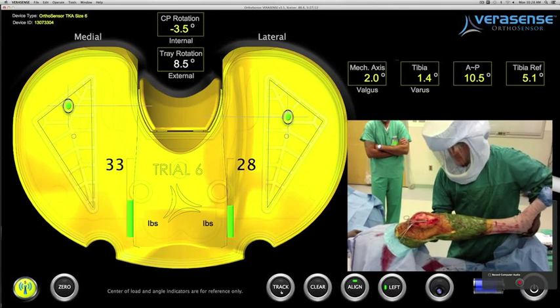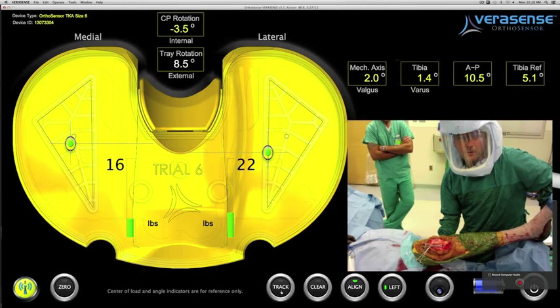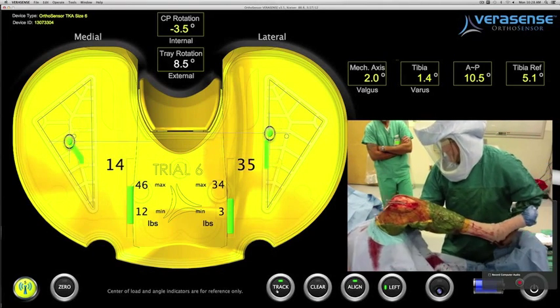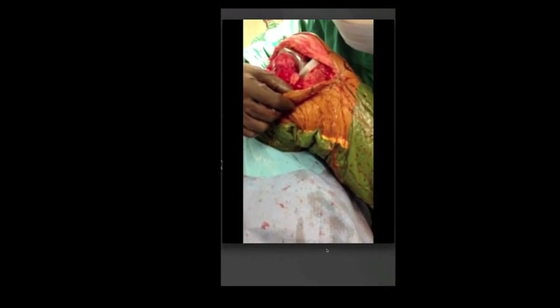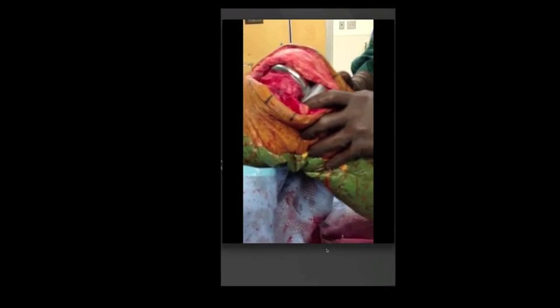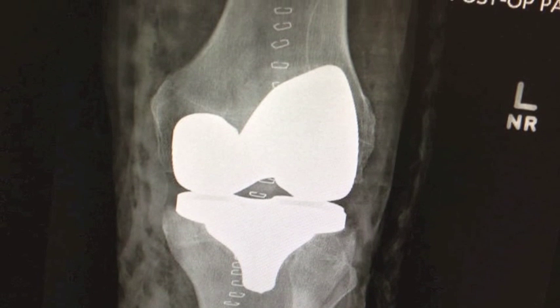The surgeon has utilized both the alignment from the accelerometer as well as the central loads through a full range of motion to optimize this patient's knee intraoperatively. He has excellent intercompartmental balance, and when taking the knee through a range of motion, demonstrates symmetrical rollback and balanced flexion and extension space. The final implant is inserted. The surgeon takes the knee through a full range of motion with excellent flexion, improved contact through the full range of motion, and a stable posterior drawer. By utilizing intraoperative sensors to define overall alignment as well as soft tissue balance, surgeons can now quantify what they feel to improve post-operative outcomes.